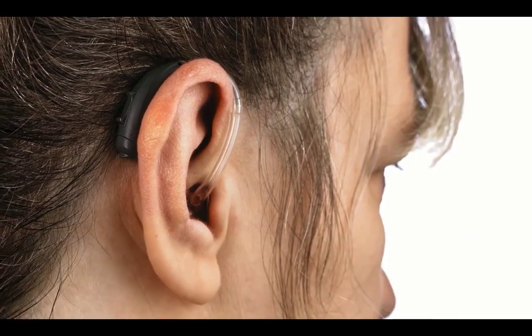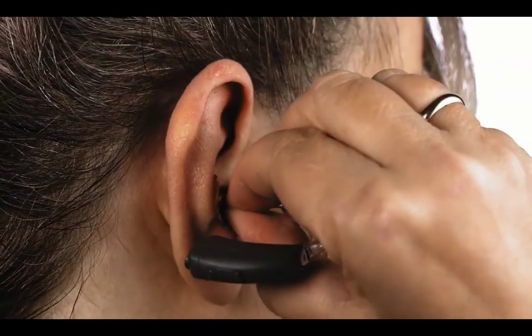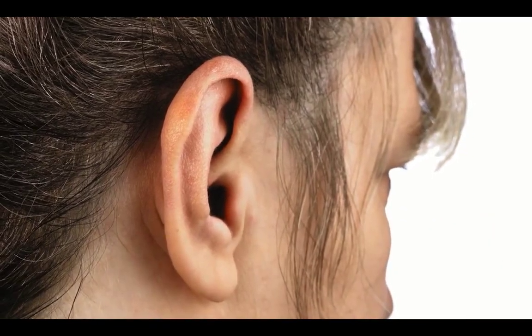The best way to apply the hearing aid into the outer ear is to extend the external canal upward and backward.